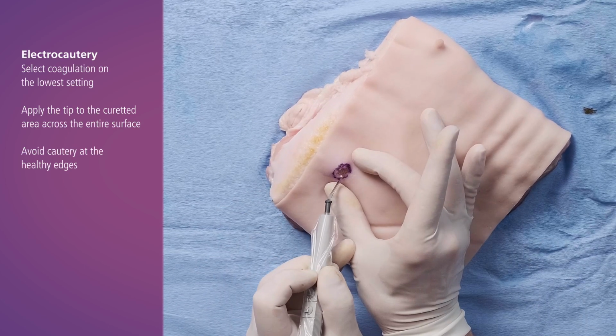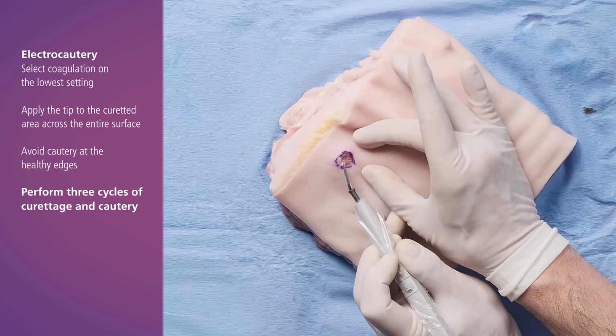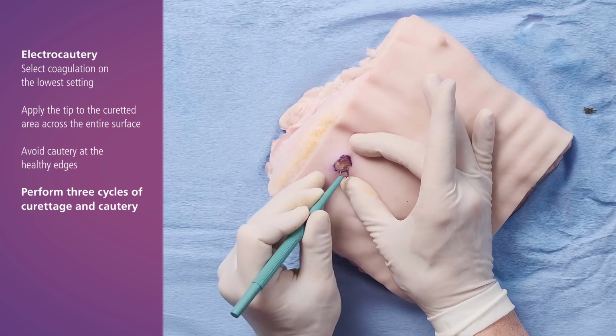The procedure is to perform 3 cycles of Curettage and Cautery, as documented cure rates assume this. Fewer cycles is equivalent to a shave and cautery, which may be a more appropriate procedure.